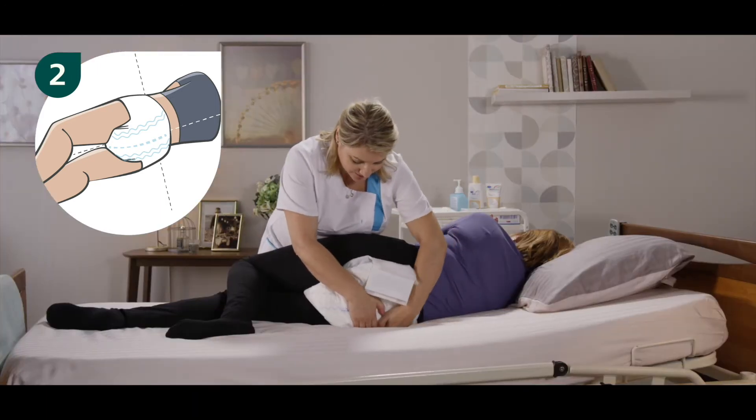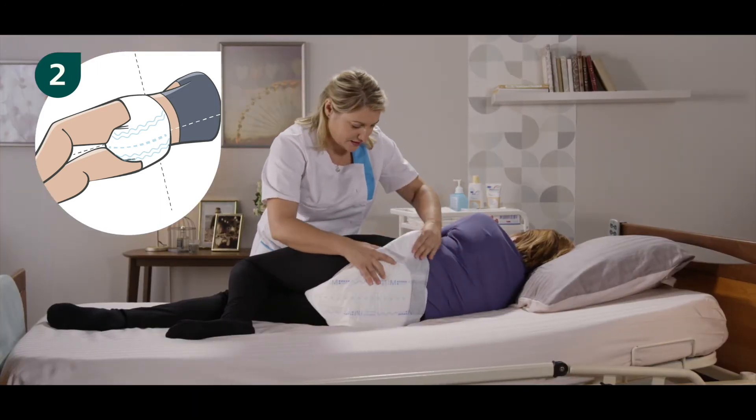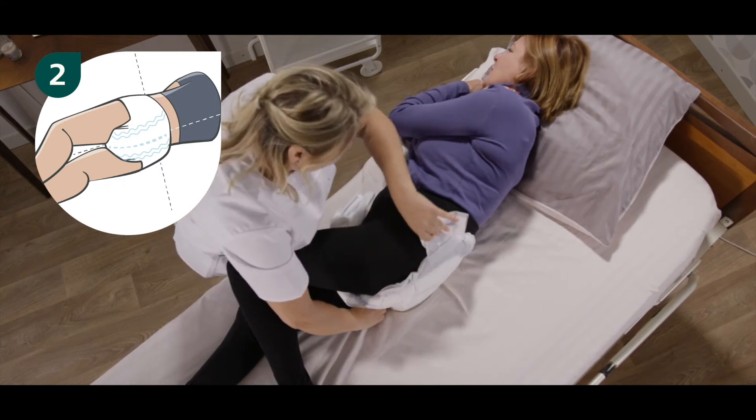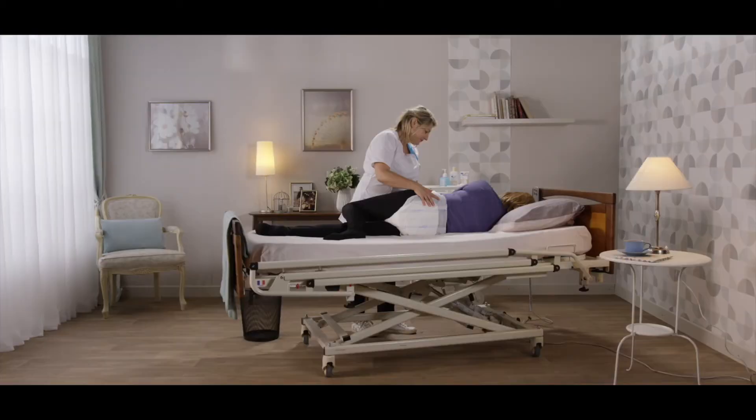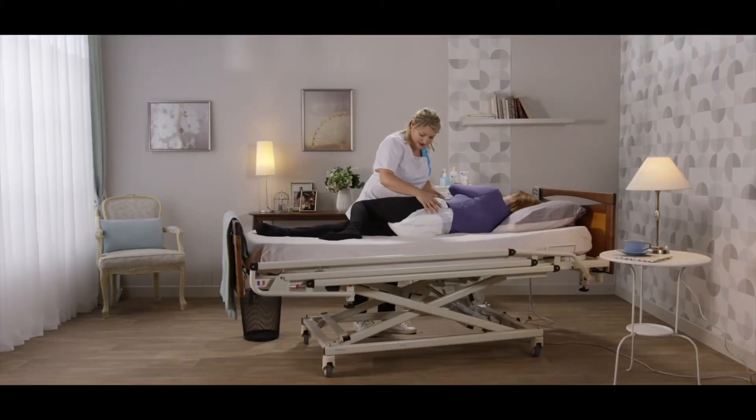Unfold the top side panel but leave the last element folded so that the hook tab does not get tangled with any textile materials. The brief will be applied properly if the central wetness indicator aligns with the resident's spine. Return the resident onto their back.